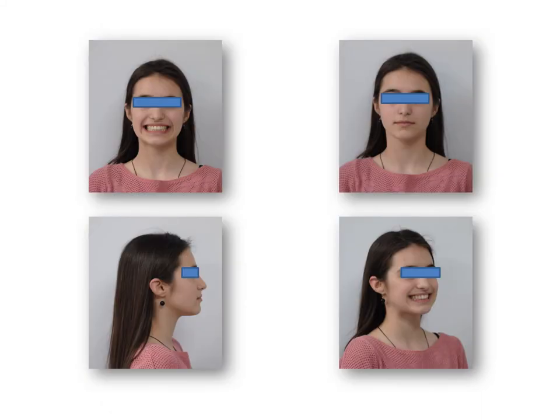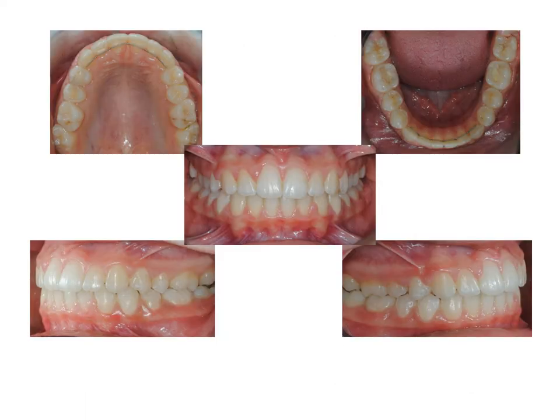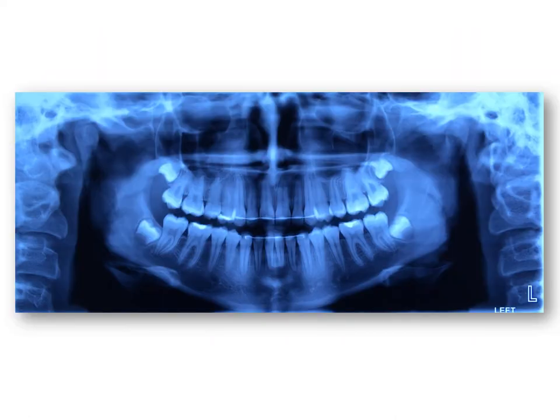And these are the extraoral photographs at the end of treatment, the changes in the smile, in the profile. She was really very happy because she didn't like her anterior teeth at all. The pictures are from the day of debonding. Nice overbite, no overjet. Class 1, both sides. This is the final panoramic X-ray.